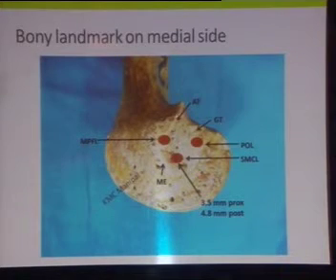So if you join a straight line between the adductor tubercle and the medial epicondyle, the MPFL attachment is right in between. If you have opened that area and dissected it nicely, just palpate the adductor tubercle, palpate the medial epicondyle, and in the center you would find the center of attachment of the MPFL. And this you can always confirm with the help of a fluoro.